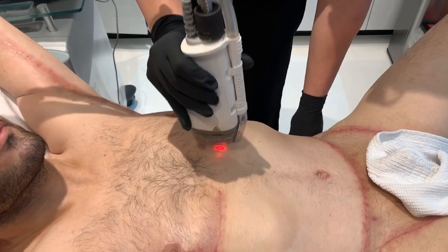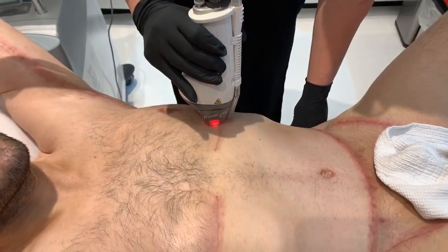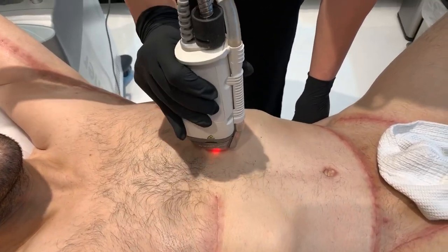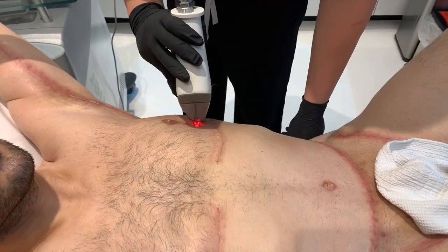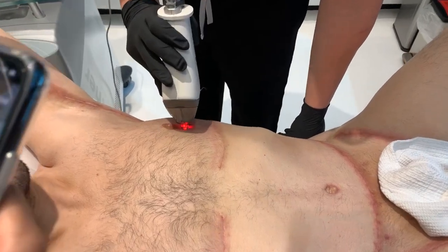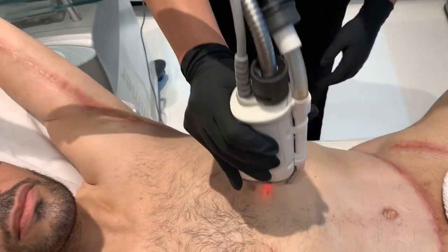What are they saying on there, guys? They want to know, will the laser make the scars peel off, or how does it fade it? No, we just talked about that, guys. This is going to form little dots in the skin, and every time those exfoliate, it will lightly fade the scar.